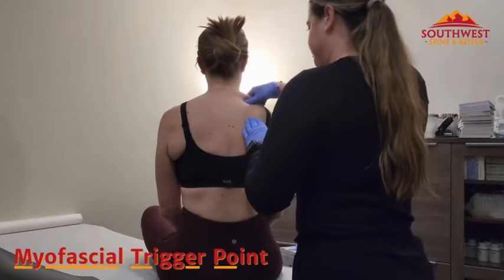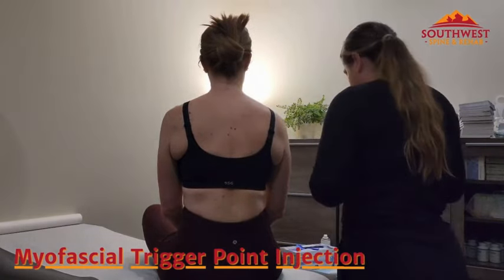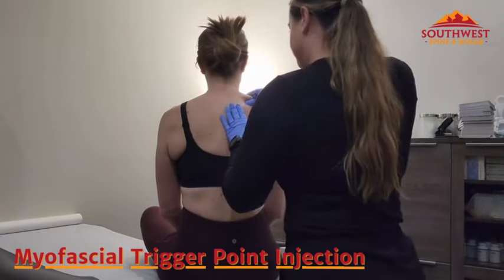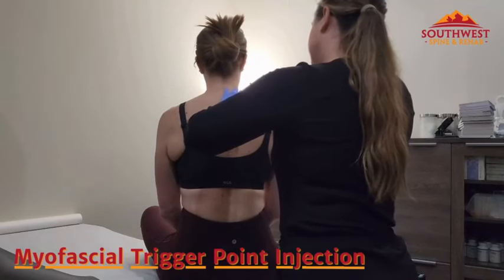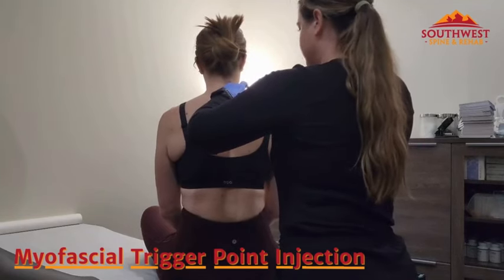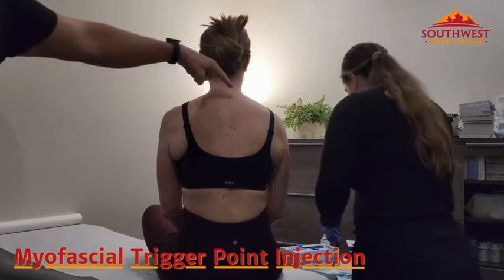So what she's doing right now is we have wonderful Mallory. She's been having some soreness in her upper right trapezius muscle. So Daisy was palpating around and she's finding a trigger point, which is a taut and tight fibers of the tissue. And she's going ahead and marking a spot that she wants to do the injection — that's what that tiny little mark was that she put on right there.